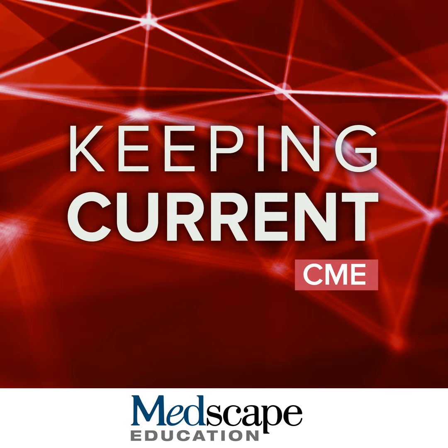In patient number 1, on the hepatobiliary phase, you can see the parenchyma is enhancing just like the rest of the parenchyma elsewhere, whereas in patient number 2, you can see a very subtle halo of decreased enhancement surrounding the lesion, and we call this perilesional hepatobiliary phase hypoenhancement. And it turns out that this is a very important feature.